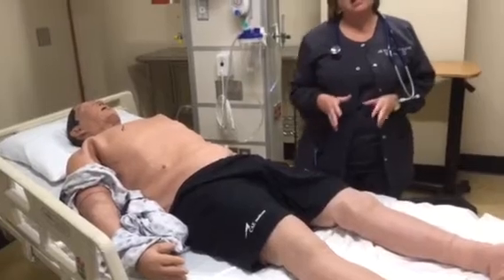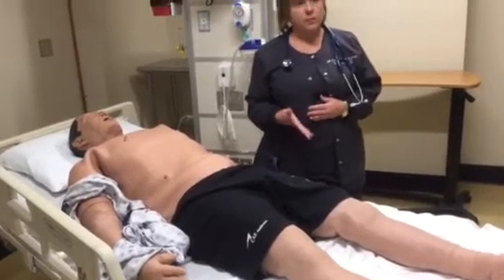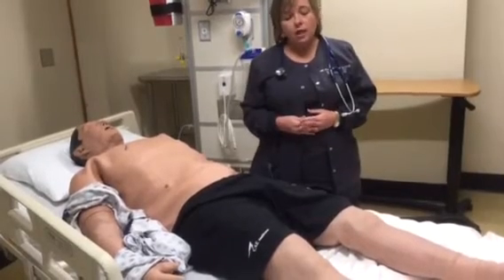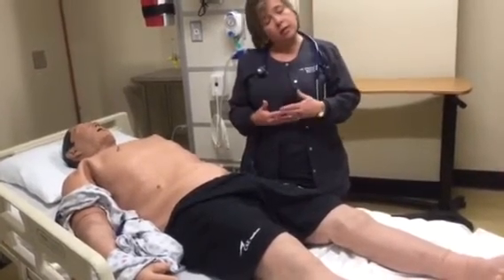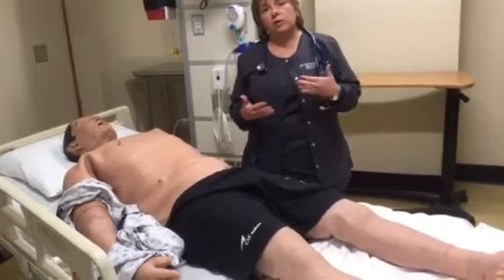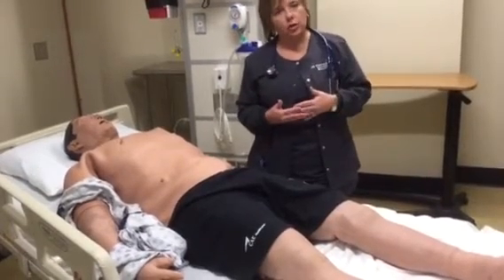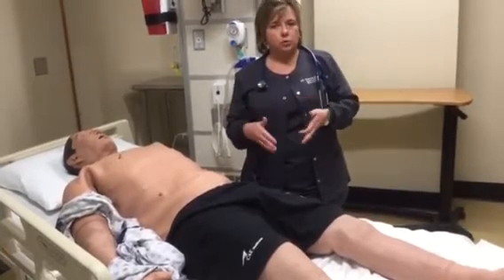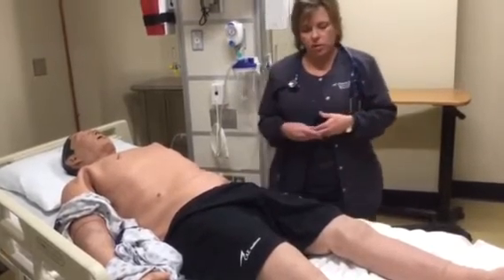And then we inflate the bulb with only 5 milliliters. So we do not inflate the bulb with 10 milliliters. If you insert a Foley catheter and you believe that you're where you should be and you don't have any urine return, then your faculty will tell you to proceed or to wait until you get urine return.